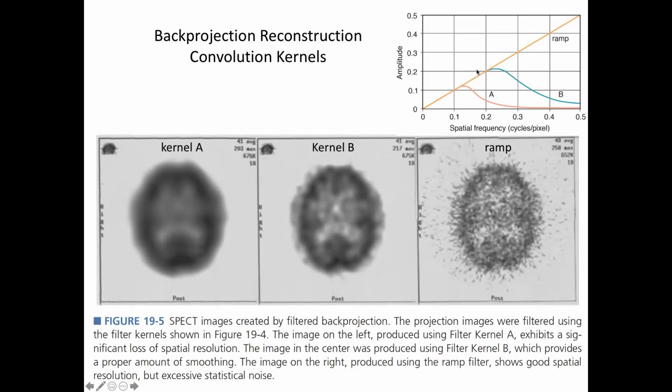And there's a ramp filter. It's sometimes called a Ram-Lak filter from its CT generation. And then there are these filters in which higher frequencies are attenuated in creating the picture. But the interesting part about all these filters is as we move to lower spatial frequencies, we eventually get to 0 at the origin, right? So the DC component is wiped out from this. Okay?